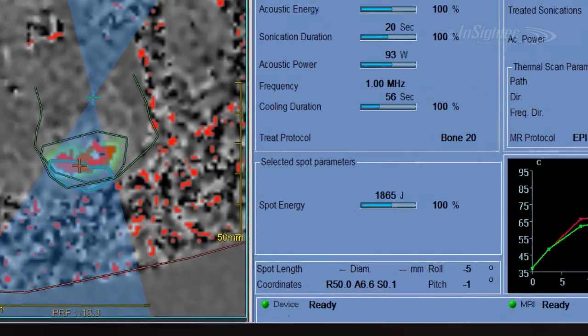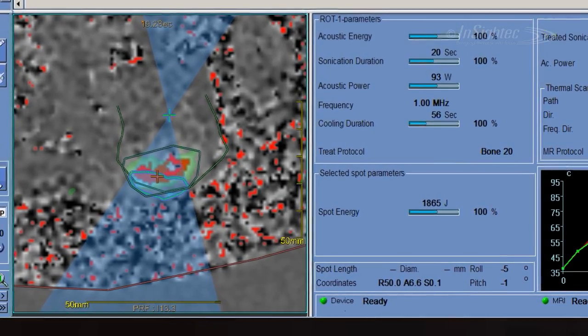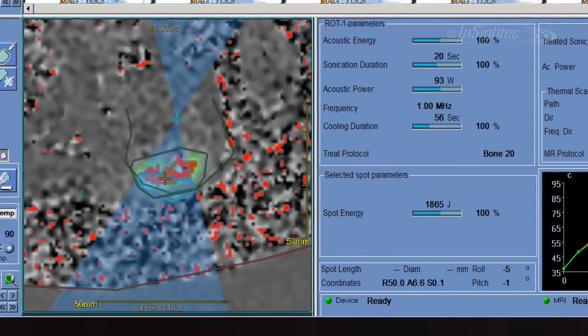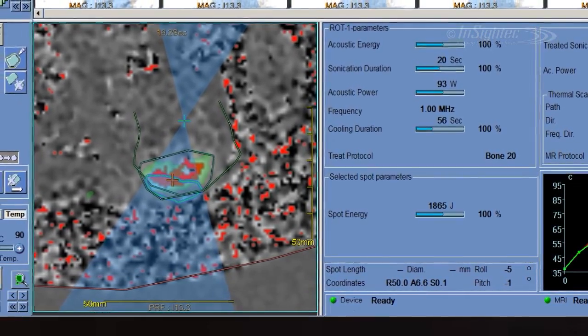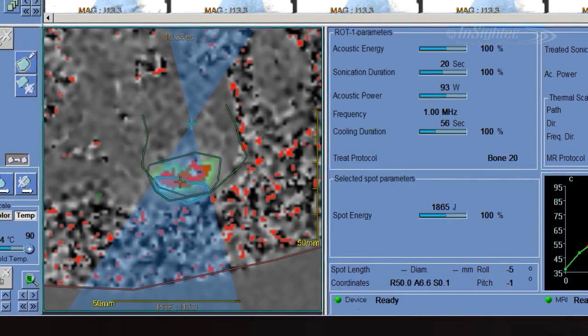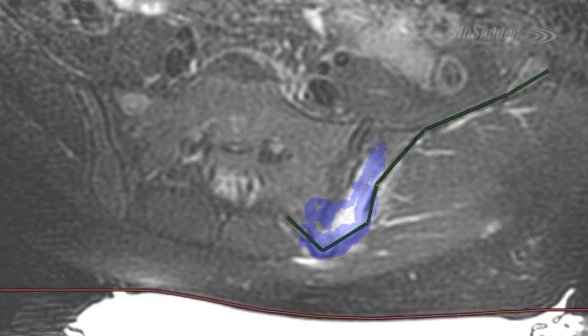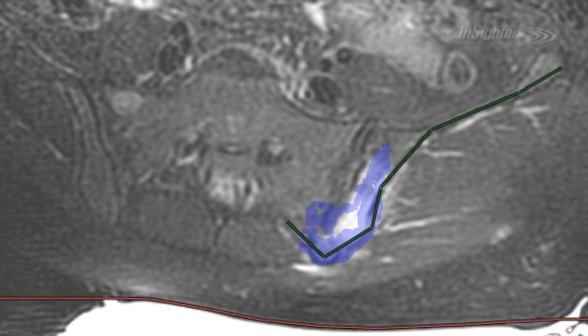After each sonication, the accumulated dose is displayed. The physician knows immediately if the focused ultrasound energy has reached the planned spot and temperature. After each sonication, the ablated area is displayed in blue as accumulated thermal dose.